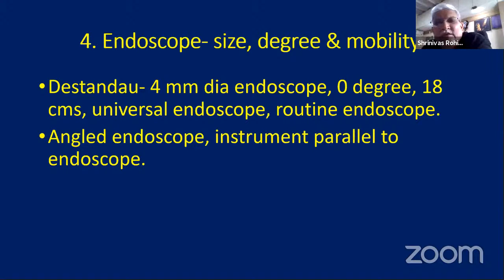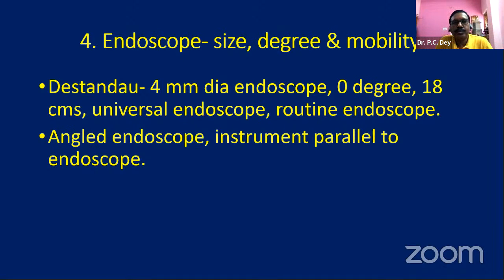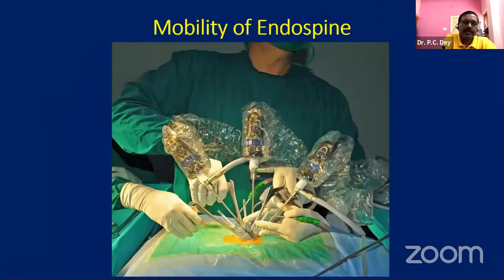No, the basic issue is that now everybody wants to use a 4 millimeter or near 4 millimeter diameter endoscope for better vision. Is that correct? So 4 millimeter is a standard even for interlaminar pure endoscopy. Yes, that is what I'm talking about. The full endoscopic system we were using before was, I think, 2.7 millimeter. They are now shifting to 4 millimeter, the endoscopes which are available for posterior interlaminar. We'll come to that point afterwards. Yes, sure. That is the take. Okay.